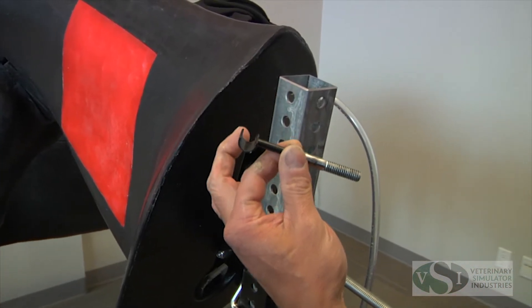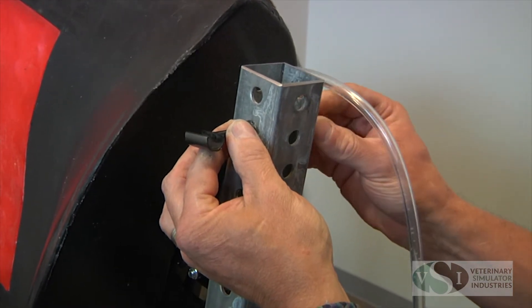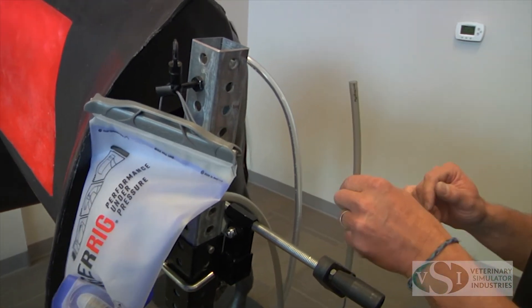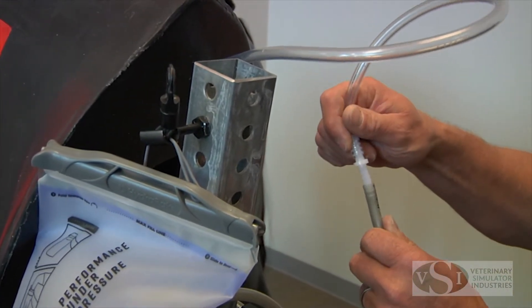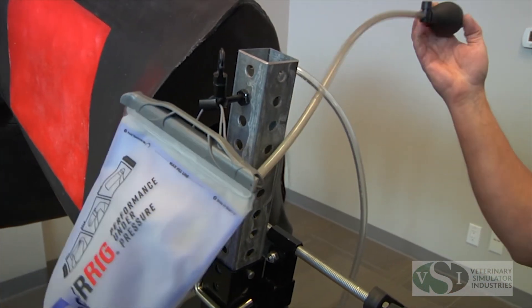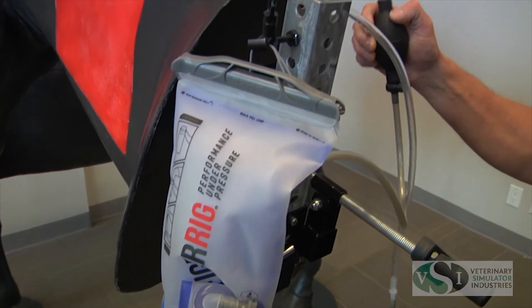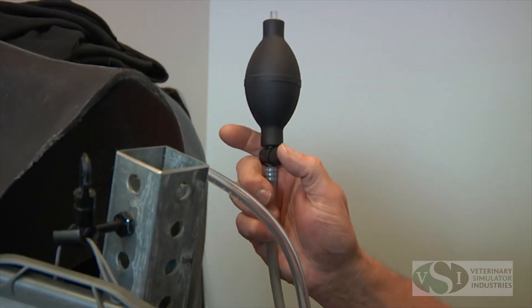The stand comes with a small metal hook which holds the venipuncture fluid bag in place. Connect the hose on the fluid bag to the hose on the venipuncture model. Use the bulb to pressurize the fluid bag. The valve on the bulb allows the air to be released from the bag when not in use.